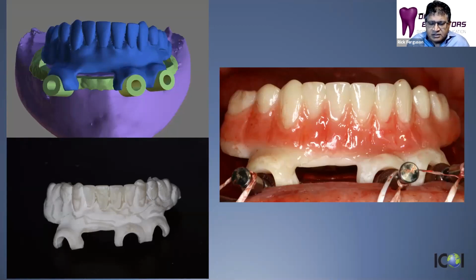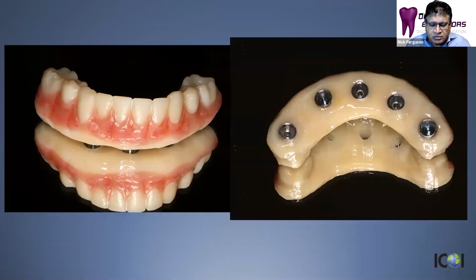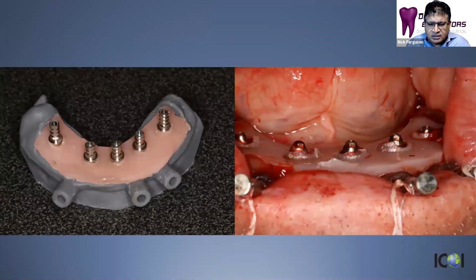And then this is stacked on top of the same bone reduction guide for the pickup. And I will typically manually drill out these injection holes because I found it easier than trying to design them in the software. But also with this particular process, we've gone from using a rubber dam to creating a gasket, basically a silicone gasket made from the same material you use to do relines on dentures, that is very, very accurate and keeps the hybrid, the temporary hybrid, from getting locked on to the multi-unit abutments when we do the pickup.